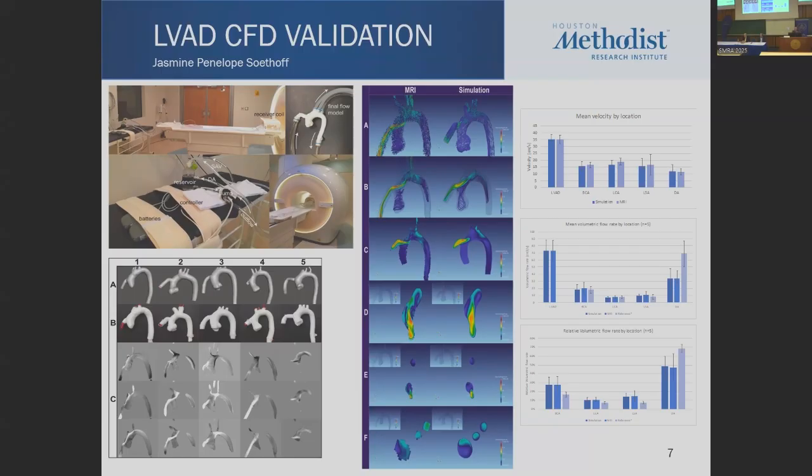And then looking at flow, 4D flow with MRI on the left and computational CFD on the right. And on the far right, you see comparison of mean velocity, mean volumetric flow, and relative flow. You can see the different outlets on that model, and you can see very nice agreement. So that went a little bit into the validation of CFD, something also very important that I learned, that you really have to have if you want to talk about patient management, patient treatment, or pre-procedural treatment.